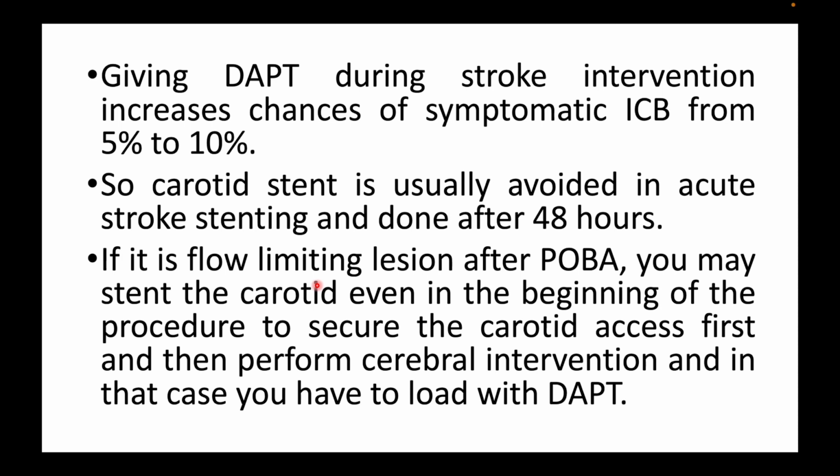The other precaution would be, if I put in a carotid stent first and then go up with a stent retriever in the cerebral circulation, then while I'm retrieving the stent retriever, it may get stuck in the carotid stent that's already deployed there. So then I have to take my guide catheter into the carotid stent and in fact above the distal edge of the carotid stent so that I capture the stent retriever into the guide before it gets entangled with the carotid stent. So that is something to remember.